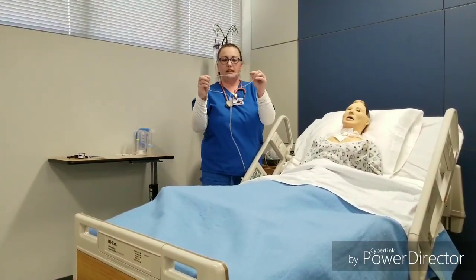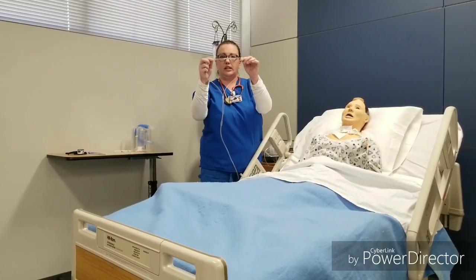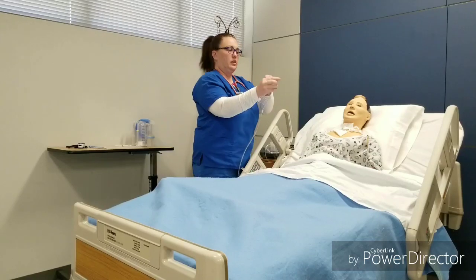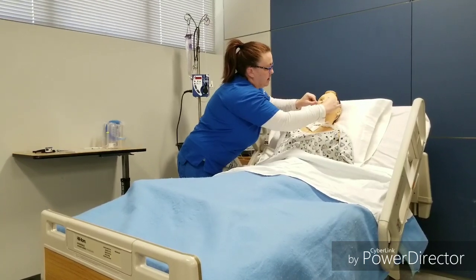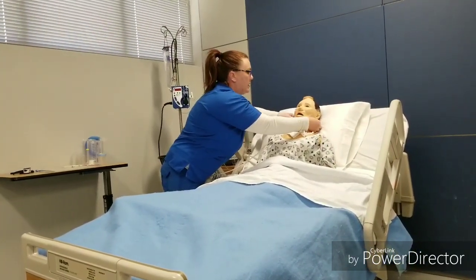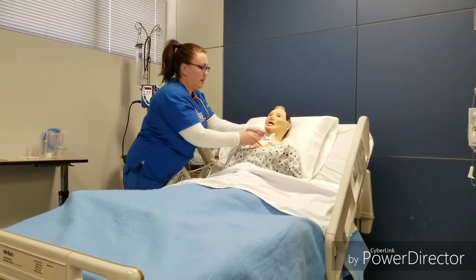and this is a nasal cannula, and it has a little prong for your nares, and you want to make sure that these are curved, and you want to make sure they're pointing up into the nose, not like this, down. And then they hoop around the ears. And make sure it fits snugly, but not too tight. And you can loosen it or tighten it with this right here.